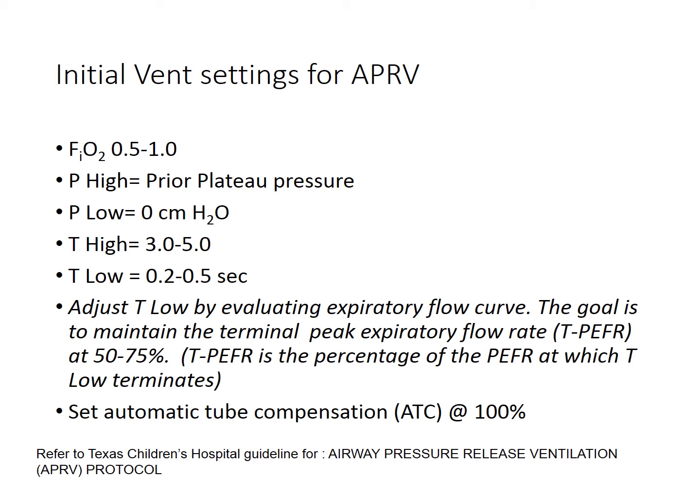What this does is add a little extra flow to the system, and since there is no pressure support for their spontaneous breathing, this is going to help with some of the resistance of the ET tube to make your patient's spontaneous breaths just a little bit more bearable.